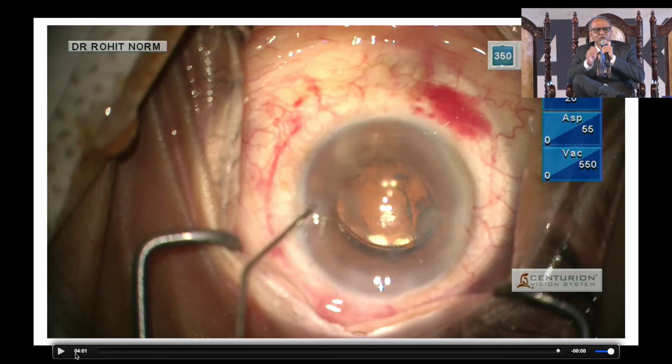What I feel is that when you are doing certain cases, you suddenly realize the moment you sculpt, it goes back. It has happened with me twice, thrice, or 4 times. I feel when you use this low IOP, you are practically negating this aspect, where when you start sculpting and use such great bottle height, such great infusion pressure, such great posterior bulging, if there is a predisposition or a pre-existing PCR, you end up with a situation wherein you suddenly find a nucleus drop.